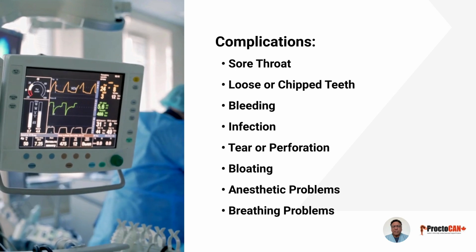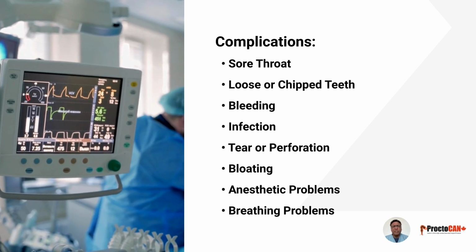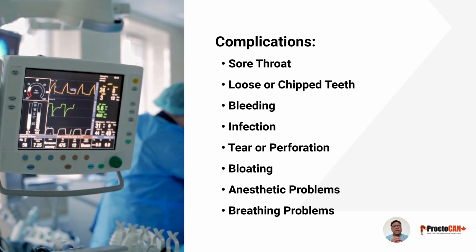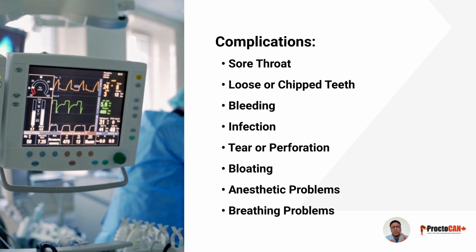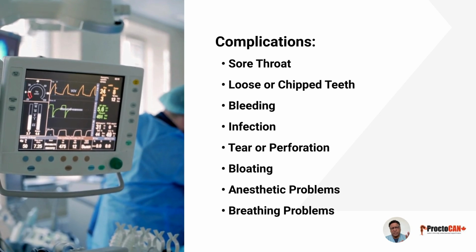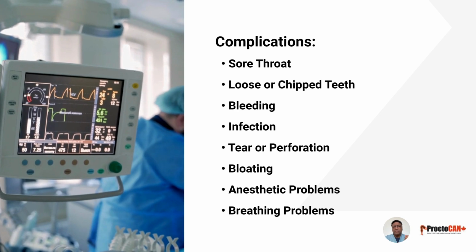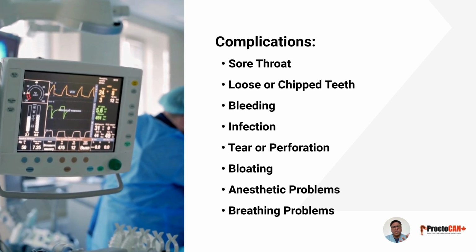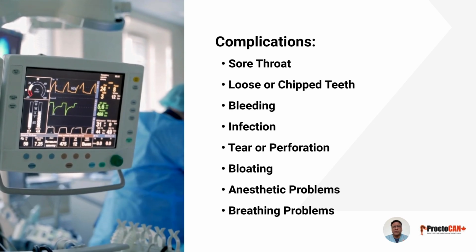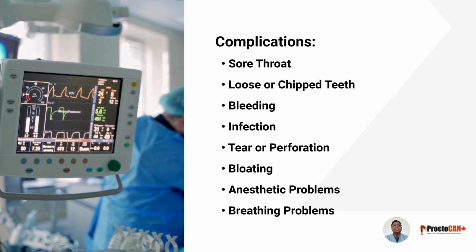Very rarely, during the insertion of the camera internally, a tear or perforation may occur in the esophagus, stomach lining, or in the duodenum, which is the upper part of the small intestine, particularly if the wall lining is thinned out and if we are trying to pass through an area of restriction or stenosis. We try to prevent this as much as possible. If it does happen, you may need further care in hospital, as you may become extremely sick without it.